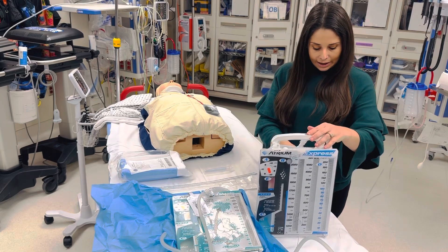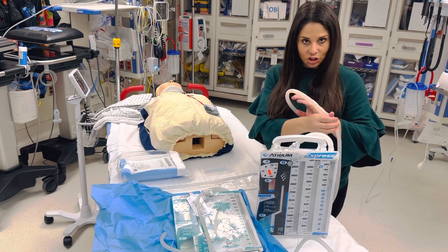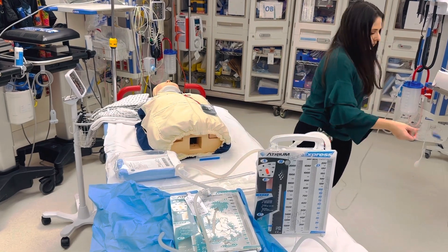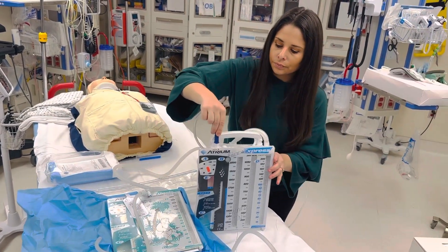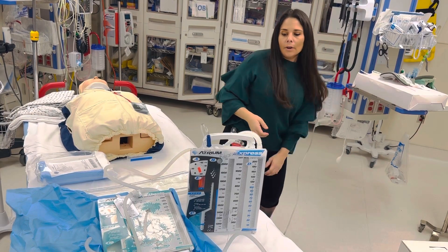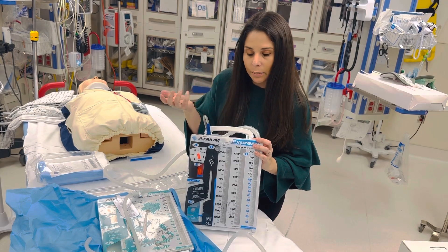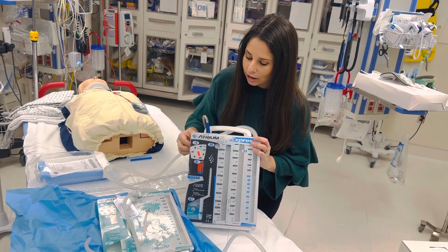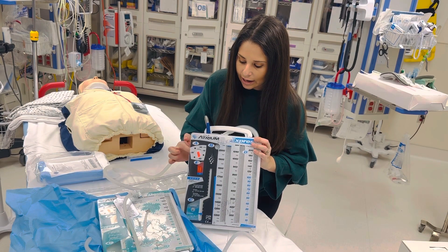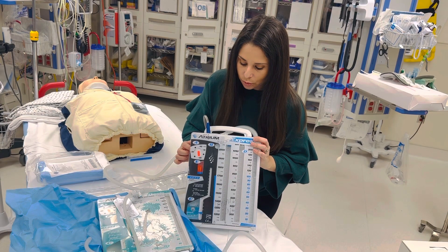Once this is set up, this end piece connects with the chest tube coming out of the patient's chest, and then you hook up your suction in the same place. When you do that, just turn your suction on. You should see this orange accordion bevel out with the suction — that tells you that you have enough suction from the wall. If you ever need to adjust suction, you can look at this dial here on the side, which is like a ferris wheel going up and down, and adjust to wherever your order is.